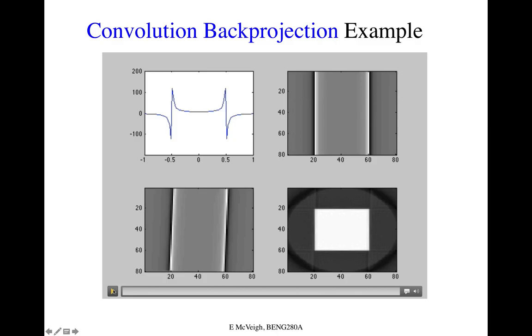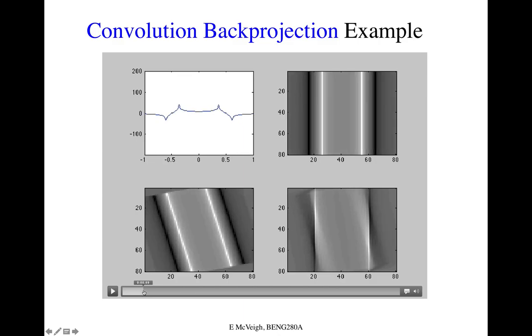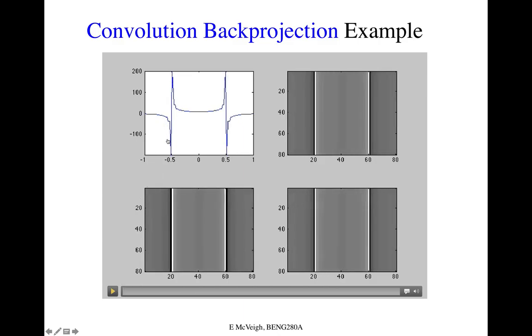Watch that again. So we can pause it. This is what G star L theta looks like when you are projecting through this square at an angle. When it's vertical, when you start out, we get these really high derivatives here. With the convolution, as it goes past this vertical edge, and remember the vertical edge in the object here, you get this really high thing. And then as we angle, that's going to soften up because we're starting to see projections through partial amounts.